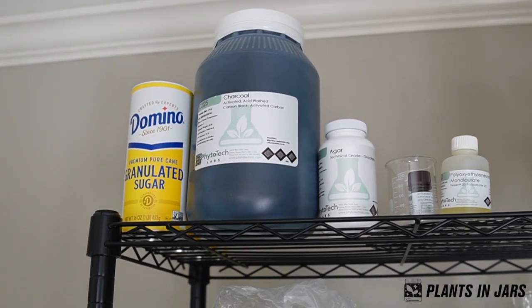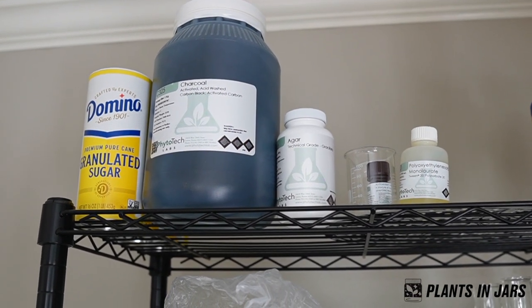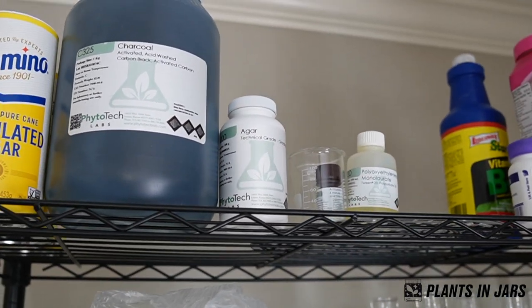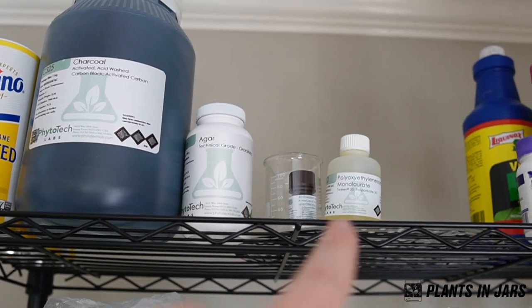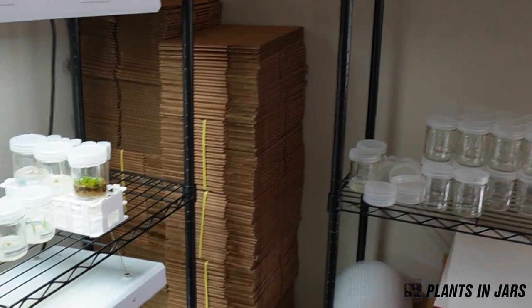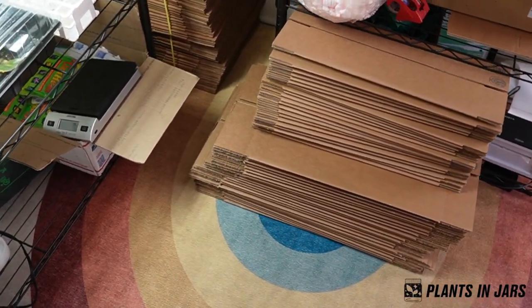And then these are some of the dry ingredients that don't need to be refrigerated for tissue culture: sugar, charcoal powder, and technical grade agar. I also do packing my Etsy orders in this room, which is why there's a ton of boxes.